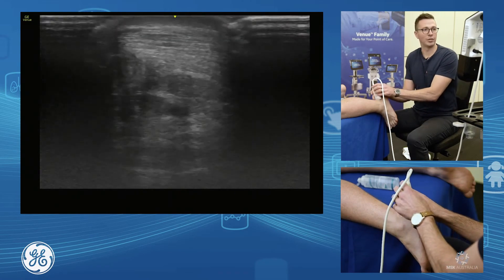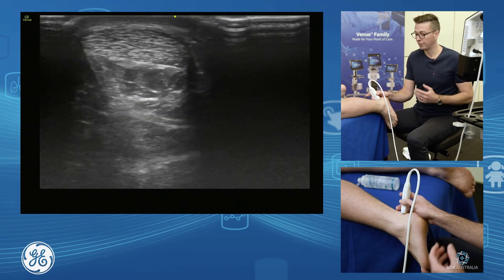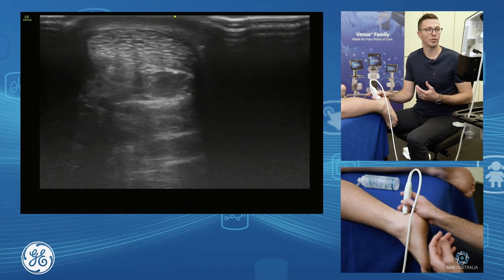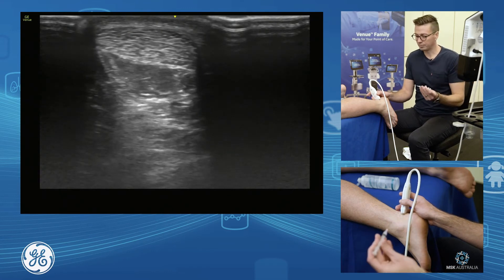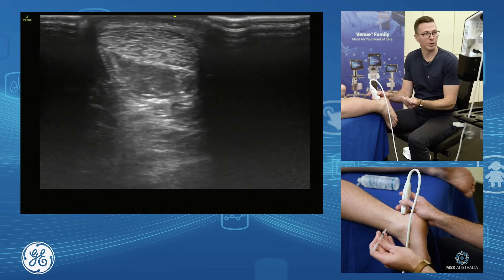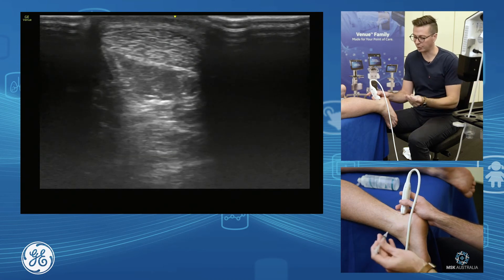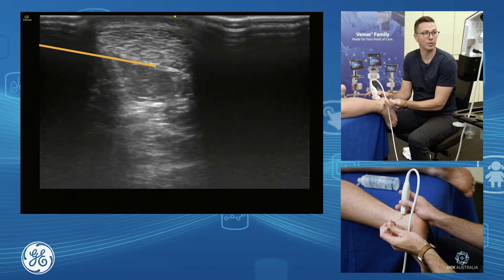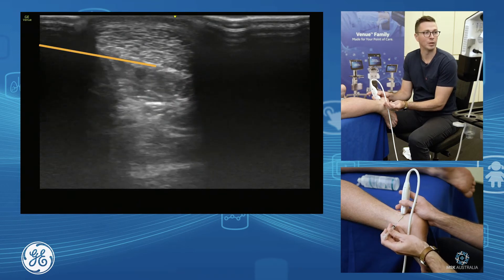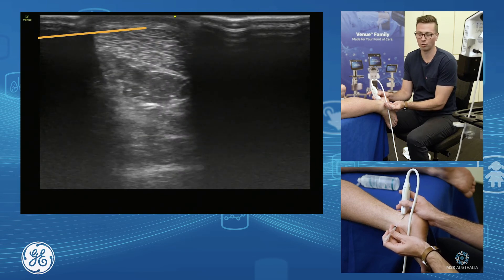For a peritendinous Achilles injection for mid-belly Achilles tendinopathy, this is how we set ourselves up in short axis over the area of greatest thickening. We grab our probe and our needle, come in and have a look at our depth — we see that our Achilles is about five to six millimetres below the skin. So we bring our needle in from a lower position and inject both below and above the Achilles tendon, doing that peritendon stripping.